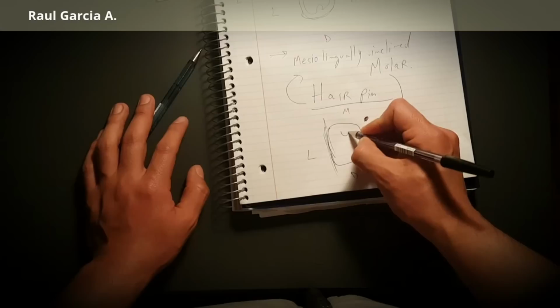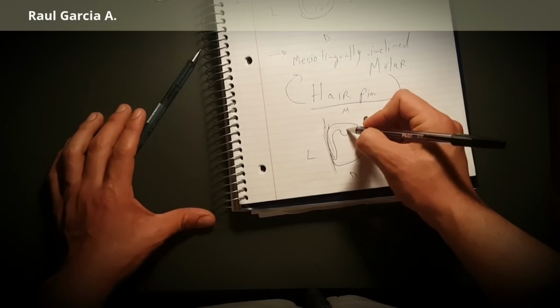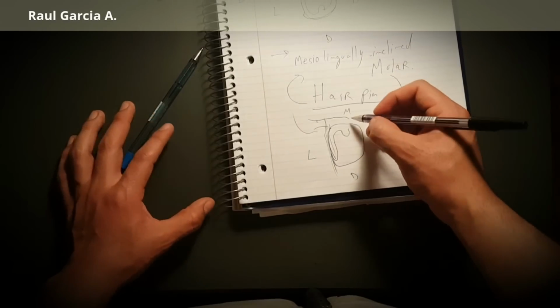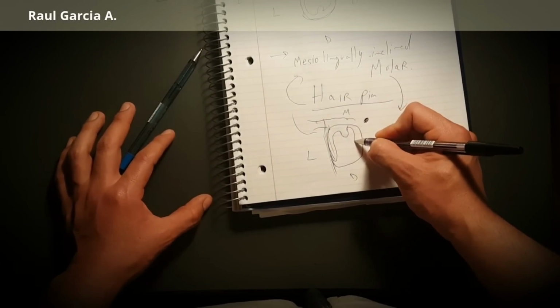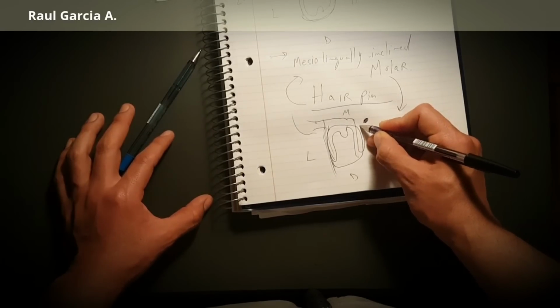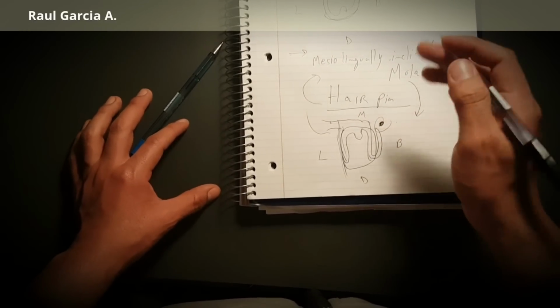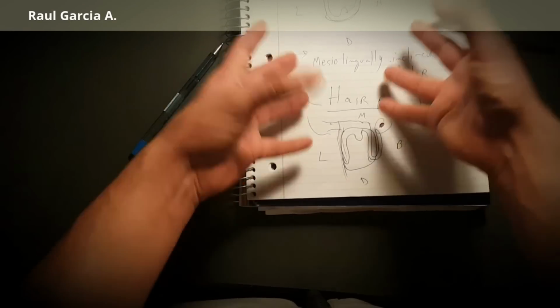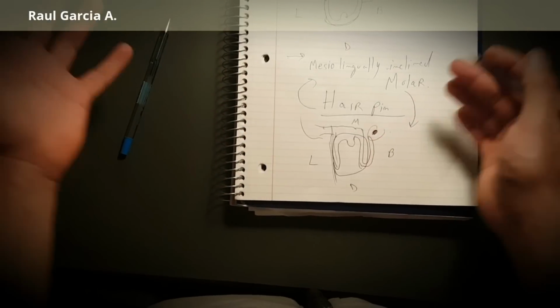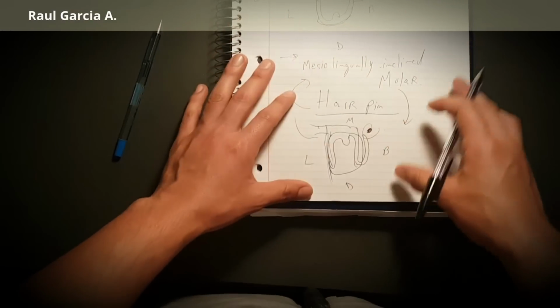So the hairpin is just like a regular cast clasp, so it has a reciprocal arm, a guiding plane there. It follows the rest of the structure, the minor connector. And then it goes like this, all the way back, and then it comes back and engages there. So that's the hairpin, it engages in the mesial buccal. That's the case when we usually use it, but we also try to avoid it. It's a lot of metal, but that's also another resource that we have, so we have to choose and decide when to use it.